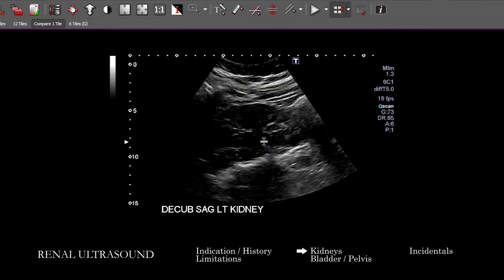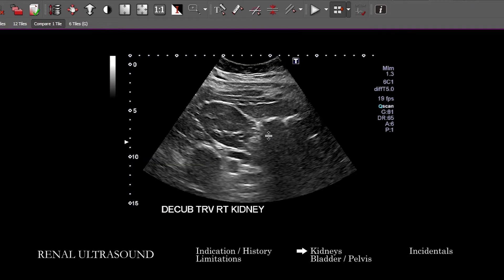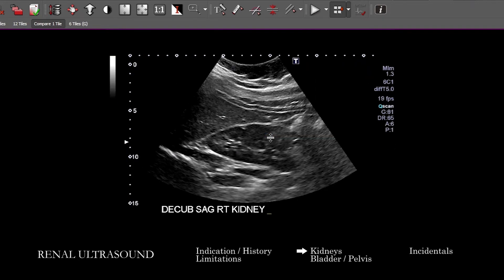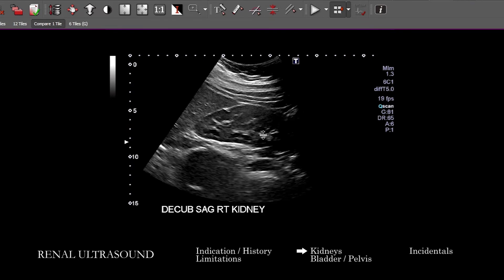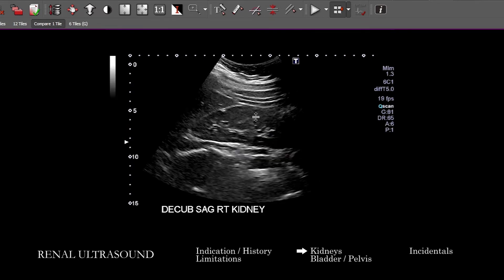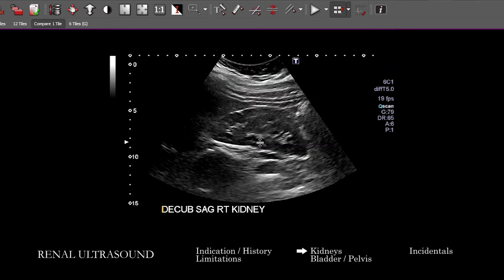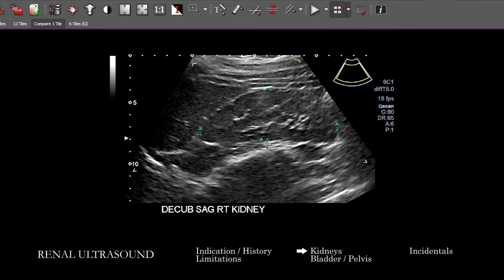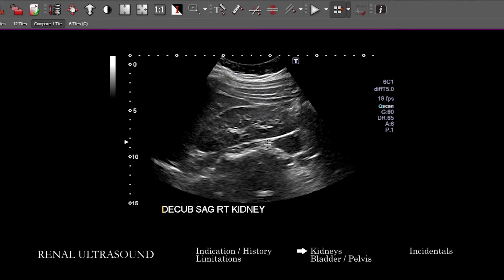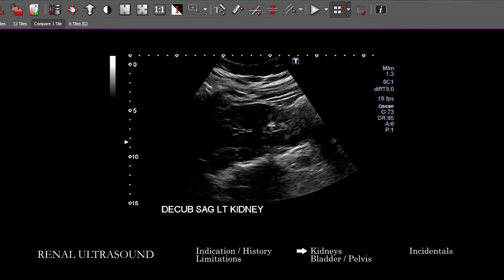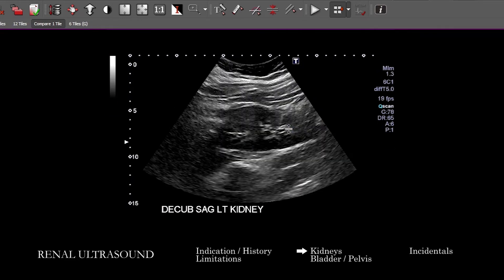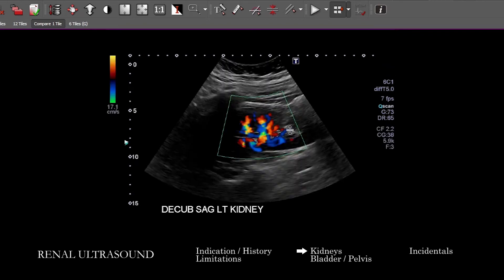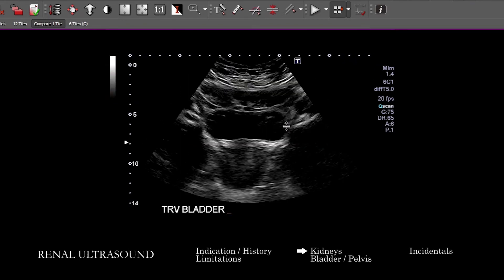Looking at this right kidney, we should be provided images that also capture the collecting system, which will be useful for assessing hydronephrosis — we can see that in the region of the renal hilum. We don't specifically have something that clearly captures the proximal ureter here. We'll do that process for the right kidney, repeat the same for the left kidney, and then take a look at the bladder.